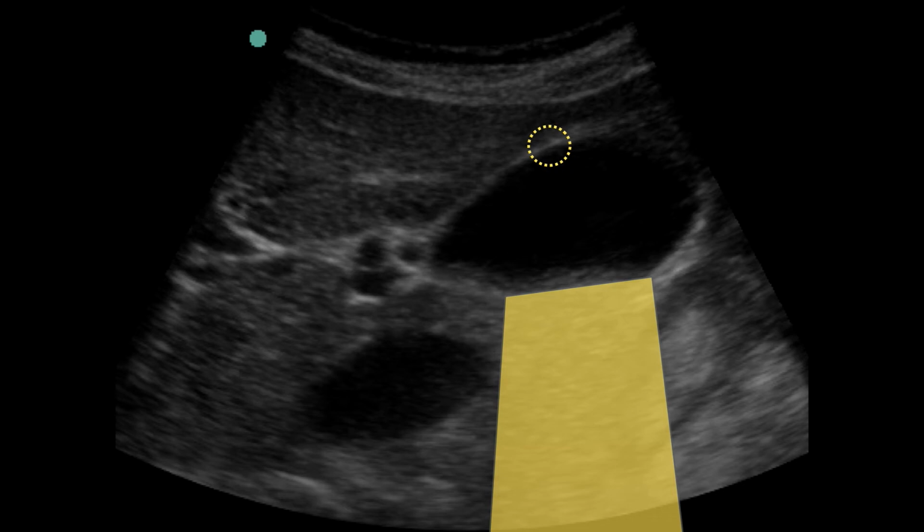So as the ultrasound beams come down and hit that fluid-filled gallbladder, which is full of fluid, it's black, it will hit that gallbladder and shoot very quickly across the gallbladder to the posterior aspect. When this occurs, the speed of the beams make it so that they reverberate at the posterior aspect of the gallbladder and create all this artifact and brightness. So you can't measure the gallbladder at the posterior wall. You always measure it from the anterior wall for accurate thickness.